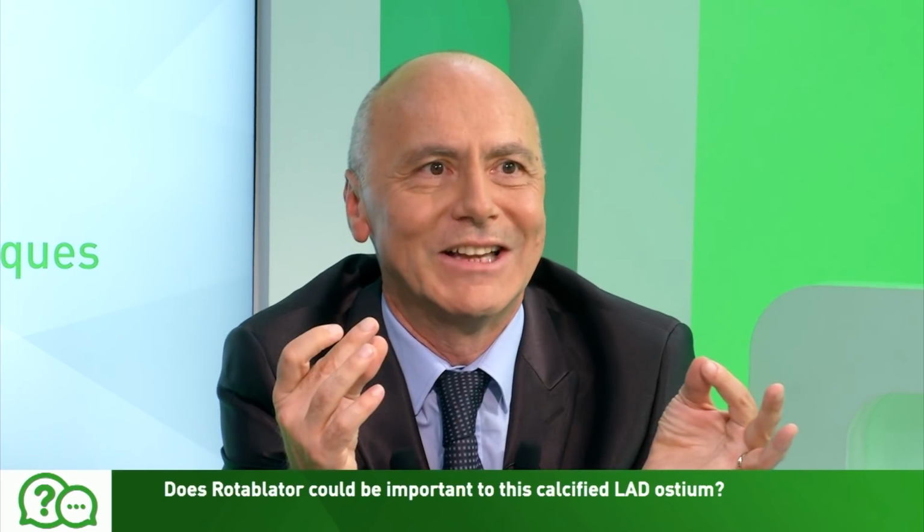Of course, when for example you have a tight, calcified lesion, and then you do 2.5 pre-dilatation and you see that waist which wouldn't go away, I mean, then of course this is a rotablator or cutting balloon case. Of course you have to prepare the lesion, in particular if this is the left main.